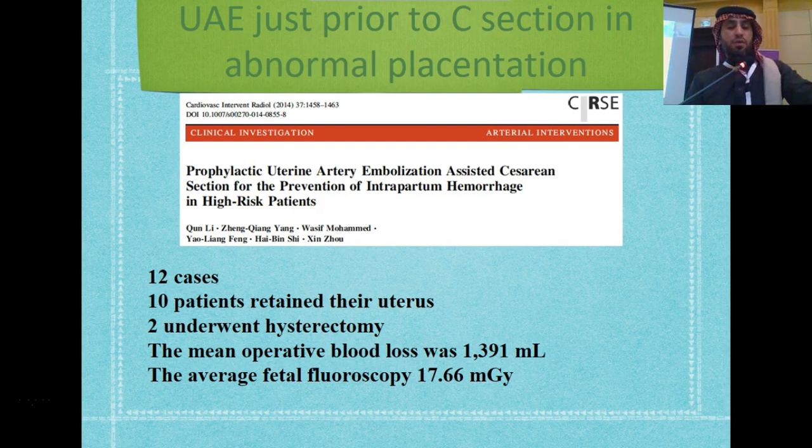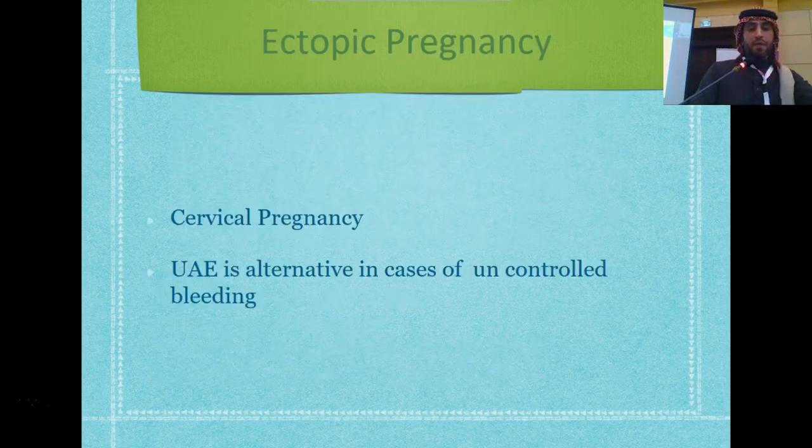Again, this paper shows that the radiation dose is higher, and the fetal radiation dose is 17.6, exceeding 10 milligray. But again, it's an interesting concept that we have to think about. What other obstetric emergency can we offer as IRs in case of cervical pregnancy, especially if the patient is not responding to medical conservative treatment?